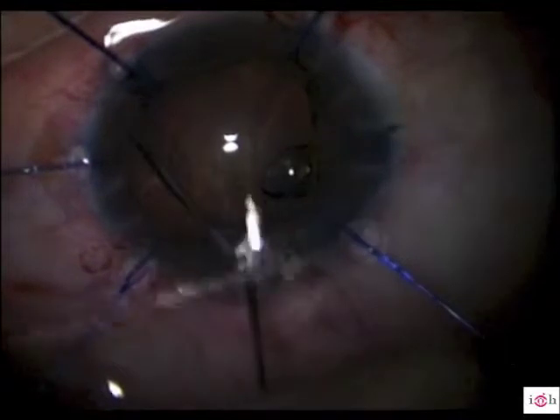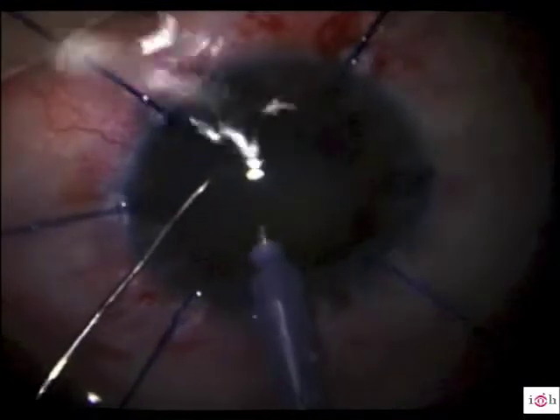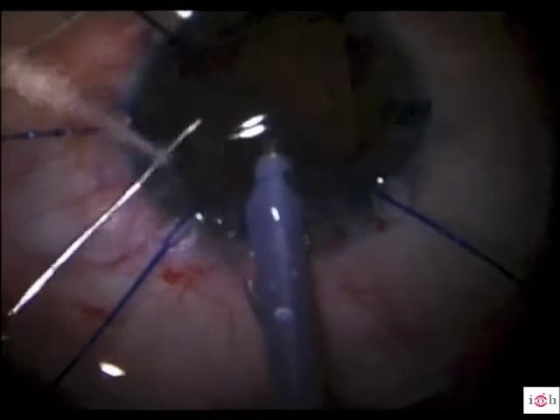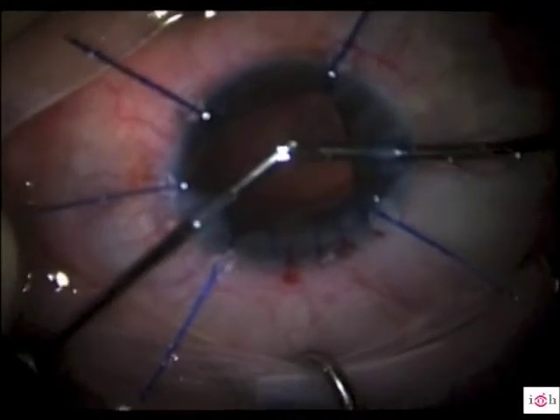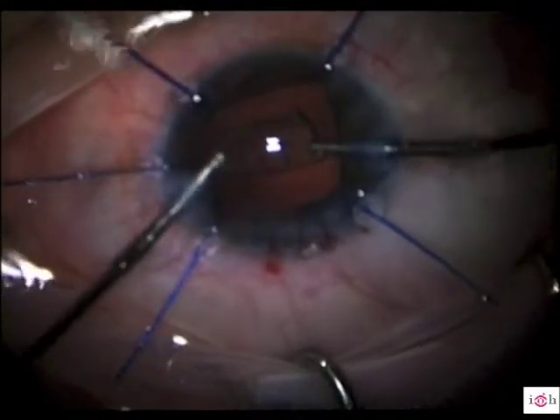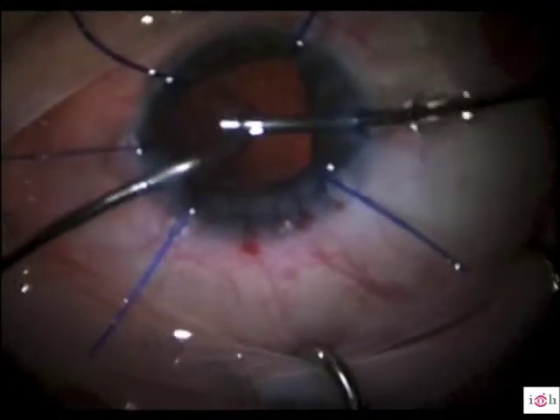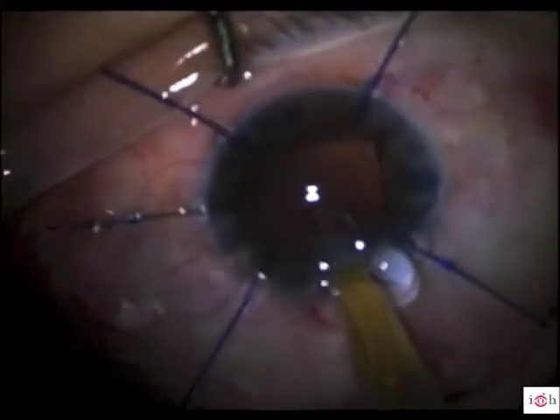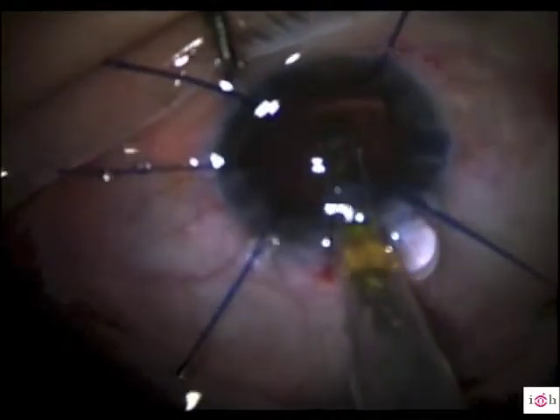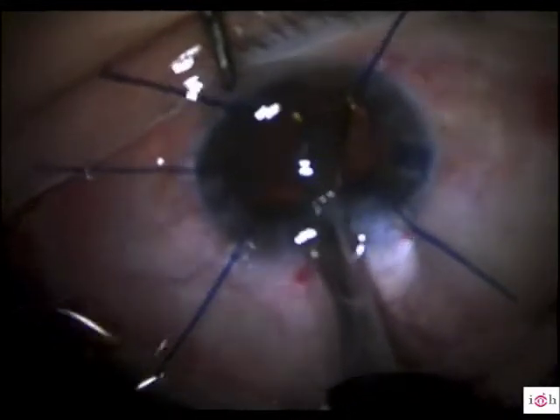Then, as in any current phaco surgery, we performed the hydrodissection, hydrodelamination, and phacoemulsification of the crystalline lens. An Acrysof one-piece monofocal IOL was implanted in the capsular bag.